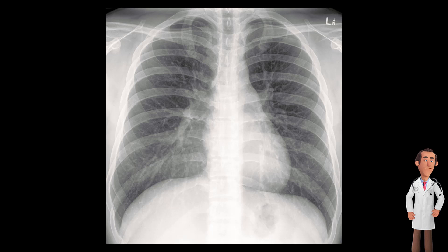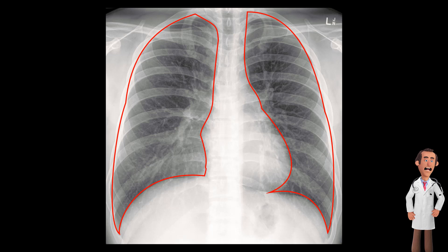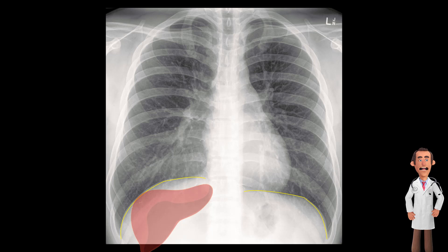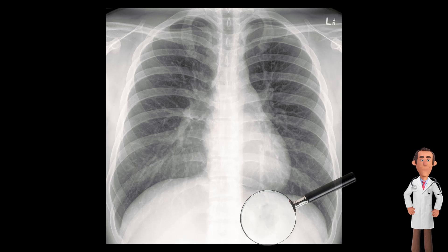When assessing the lungs, it is important to look at the surrounding pleura and both hemidiaphragms. These hemidiaphragms should have a curved shape and sharp costophrenic angles, with the right hemidiaphragm higher than the left due to the underlying liver. Occasionally, on the left, under the diaphragm, you can see a gastric bubble. This is a normal sign.